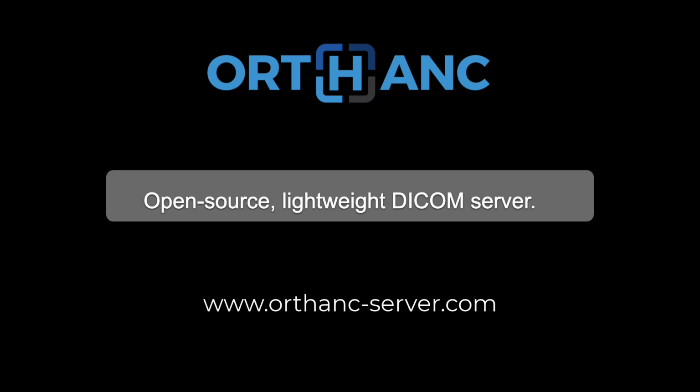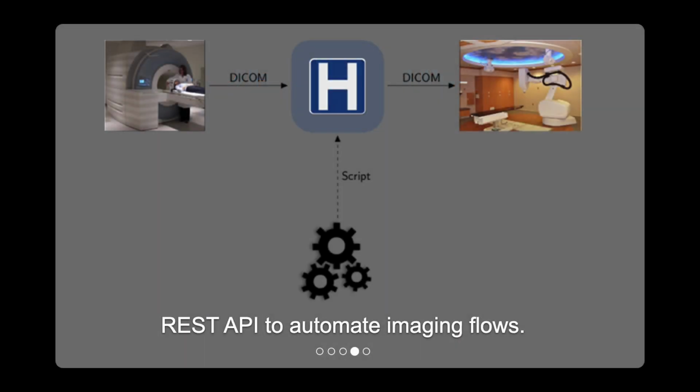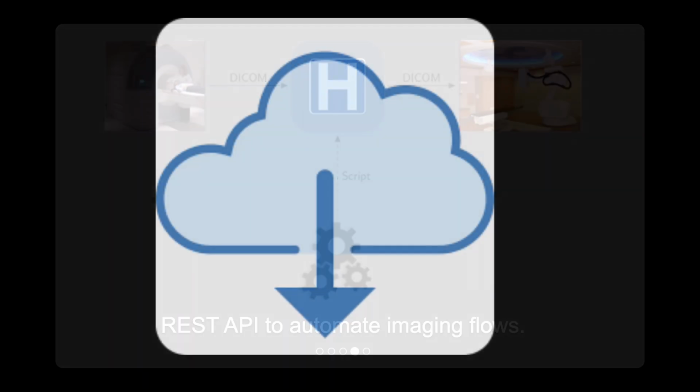Another deserved shout out goes to the Orthanc server, an open source, free to use PACS VNA implementation. Tools like Orthanc are helpful on their own, like in small clinics, or when augmenting commercial products, such as last mile integrations or even as a PACS instance for research projects. In the case of this demonstration, we used Orthanc to bring results produced in the cloud back to the on-premises network.